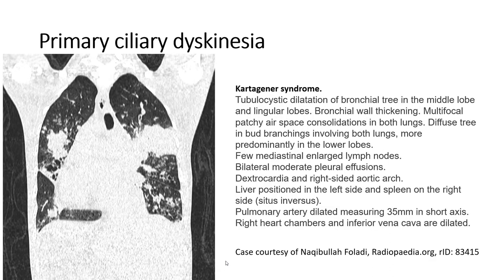In another case of Kartagener syndrome, there is tubular and cystic dilatation of the bronchial tree in the middle lobe and lingula. Bronchial wall thickening and mucus plugging are seen in both lungs, more predominant in the lower lobes.